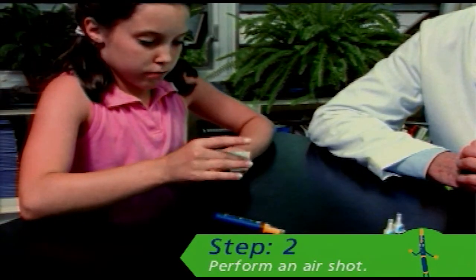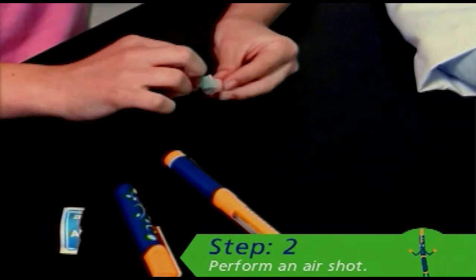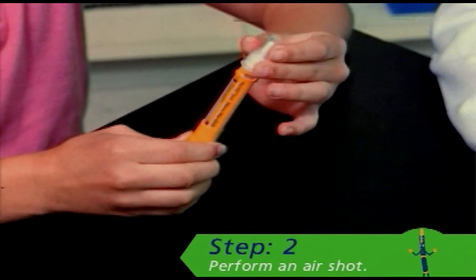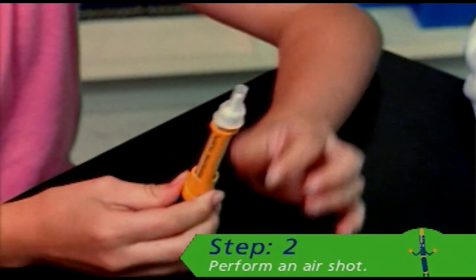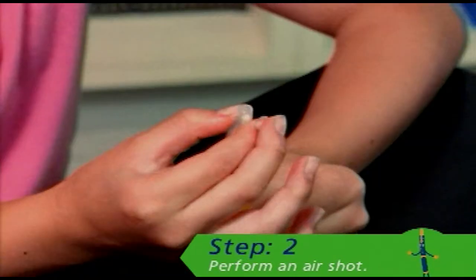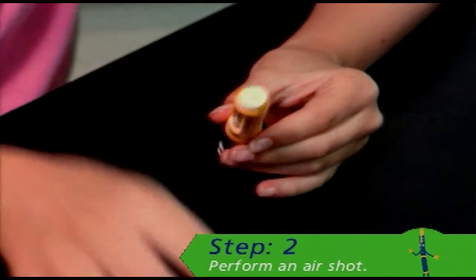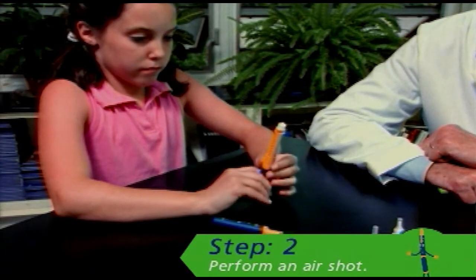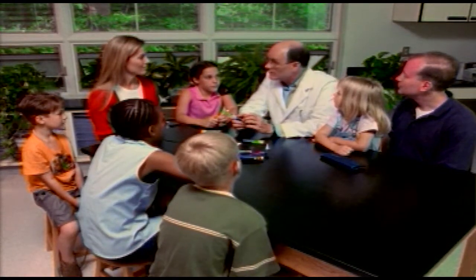First, attach the Novofine disposable needle by wiping the rubber stopper of the cartridge with an alcohol swab, removing the protective tab from the needle, and then screwing the needle onto the end of the cartridge. Next, turn the dial-a-dose selector until two appears in the dose indicator window. Then remove the outer and inner plastic needle caps. Finally, while holding the pen upward, tap the pen-fill cartridge holder with your finger a few times to release any air bubbles and press the push button as far as it will go. A drop of insulin should appear at the needle tip. If not, repeat these steps until a drop of insulin appears.